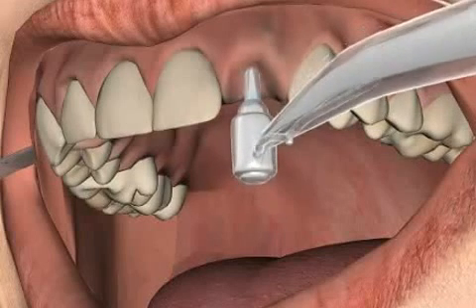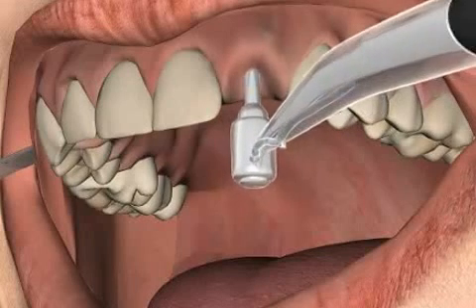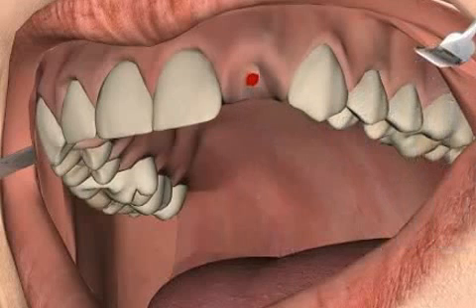The lips are protected by a rubber cuff. The mucosa does not have to be cut open during punching, as only a small hole the size of the implant needs to be punched. The patient experiences less pain in this procedure in comparison to a tooth extraction.